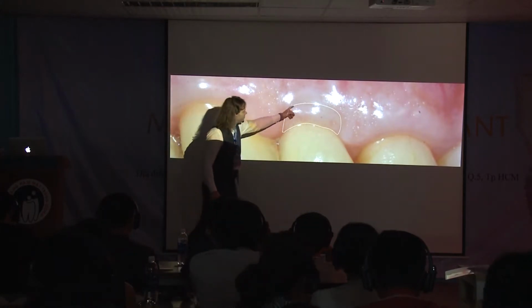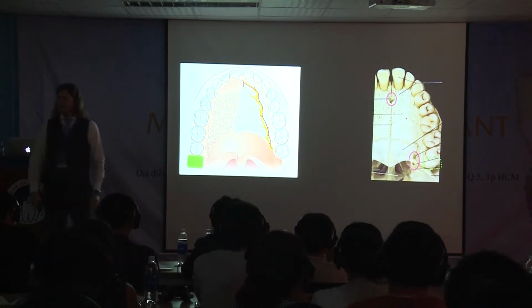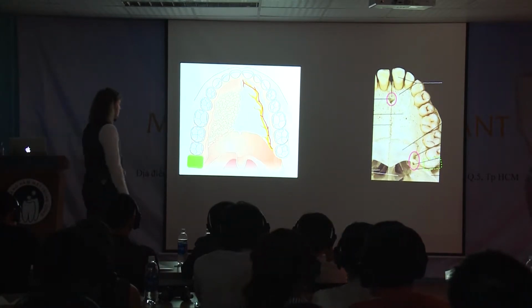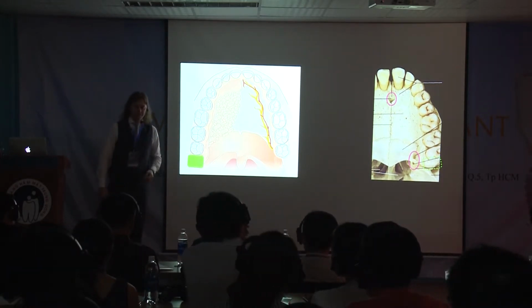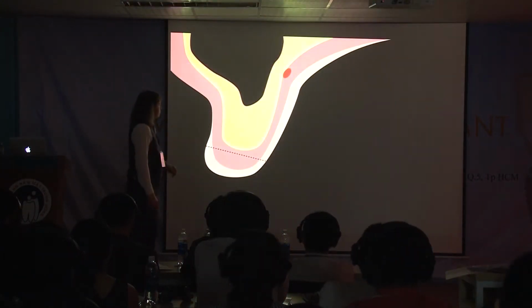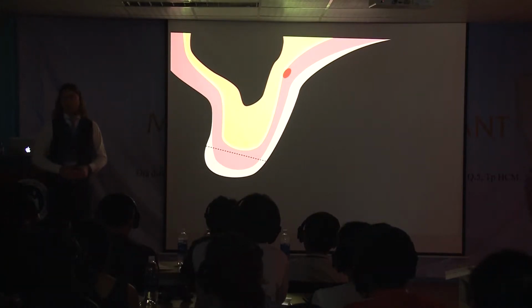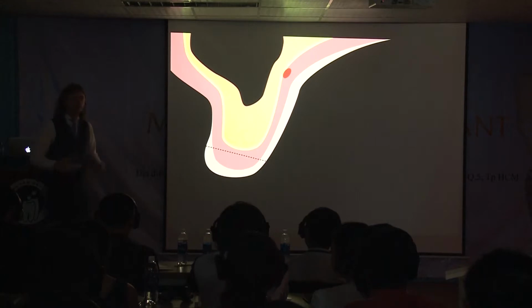The ones in the front can still see the presence of the graft. Then we have something which is very difficult to use, and it's the third choice for grafting, which is the tuberosities. The tuber is huge most of the time, and if you don't have the wisdom teeth, probably you have 7, 6, 8 millimeters of very thick tissue you can harvest.